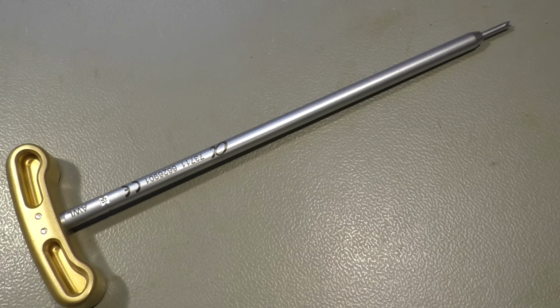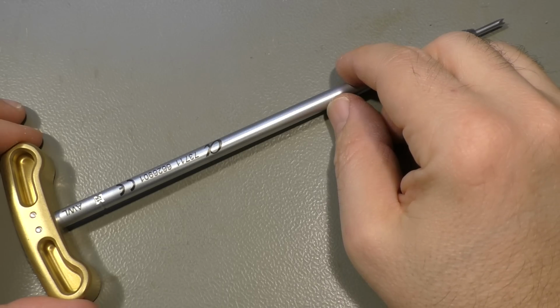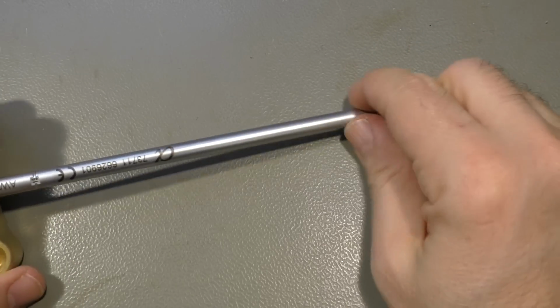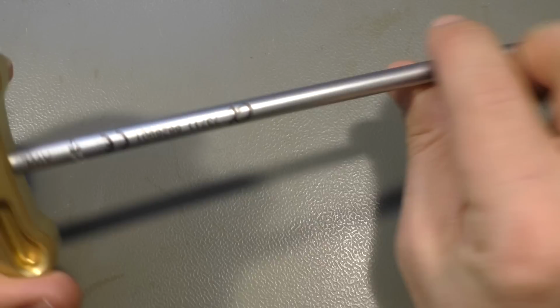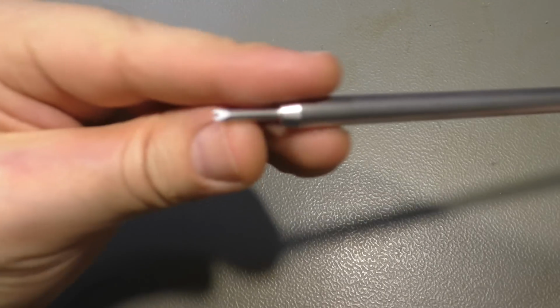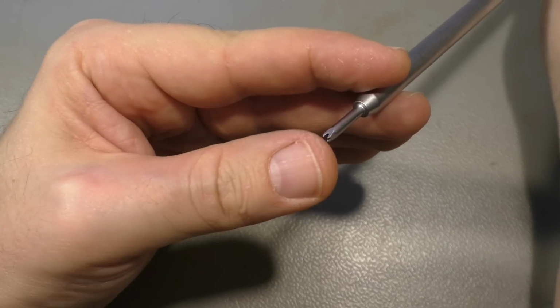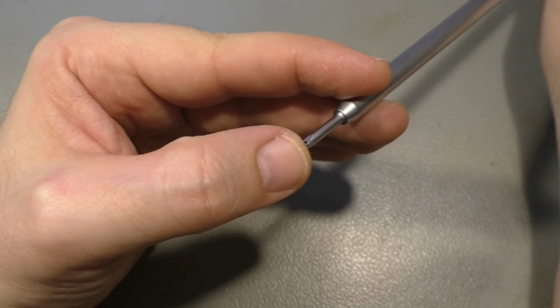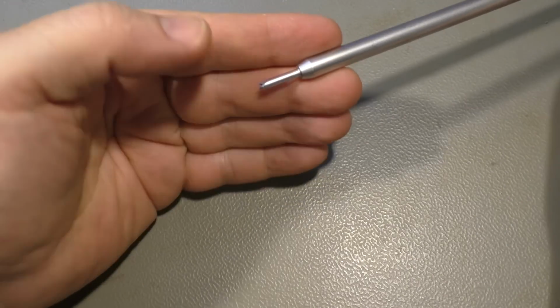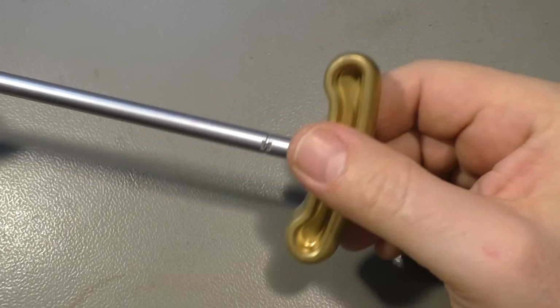Okay, there's not much more I can do with that set because some parts are missing, some parts are quite unusual, but what we can do is some tool porn and let us see these things a little bit closer. So that's the awl to pre-drill holes, and I can tell you it is super sharp. So I wouldn't touch that too much, but I like the golden handle here.